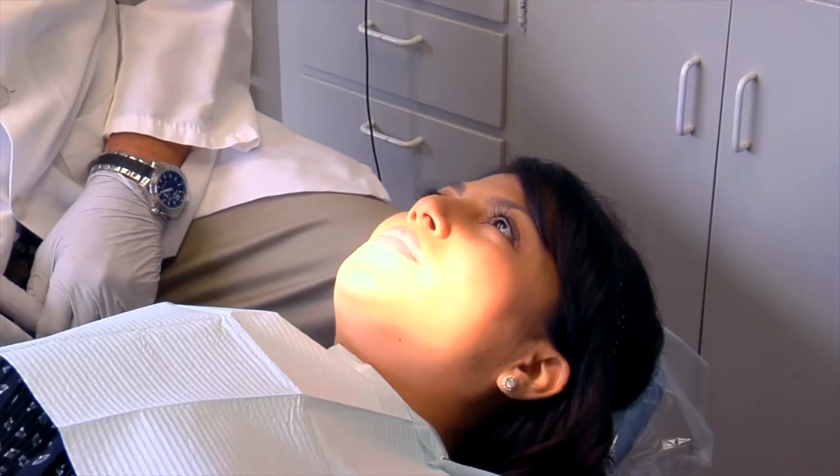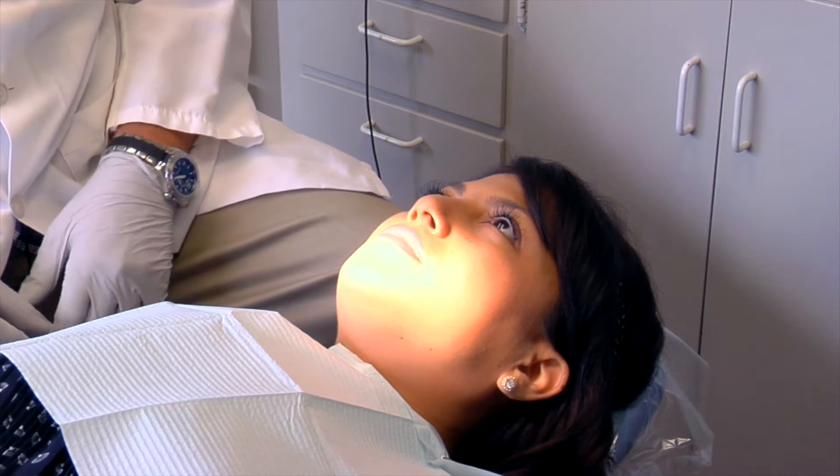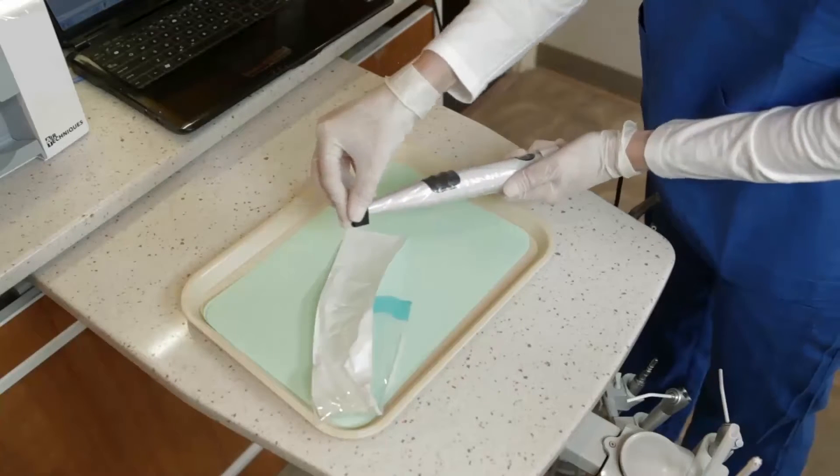Now let's talk a little bit about how Spectra works. Today we have a patient here — this is Sheena. Sheena is ready to have an exam done on her. Most of the time in our office this device is being used in the hygiene room, after a hygienist is finished cleaning the patient's teeth.